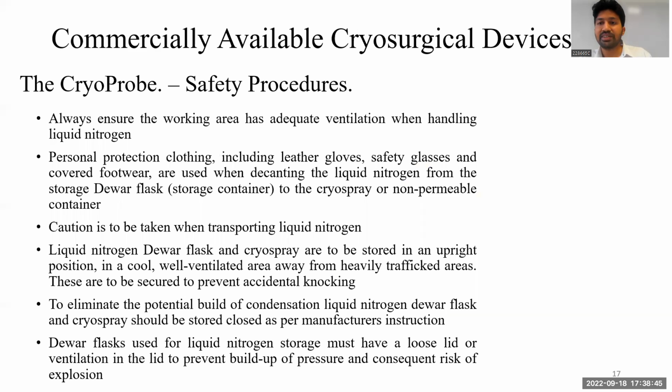Apart from that, we have some general safety procedures that need to be followed when you are using the cryosurgical cryoprobe. These can be summarized as handling the instrument and the liquid nitrogen properly, wearing proper PPE, and having enough ventilation when you're using it.